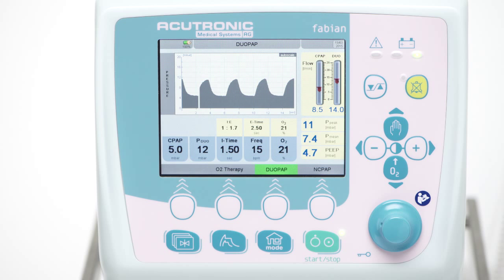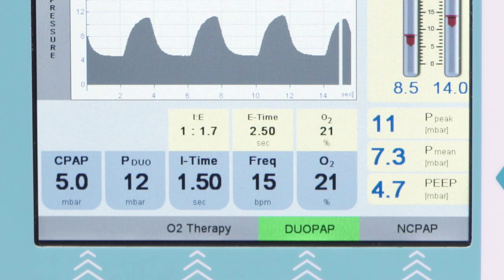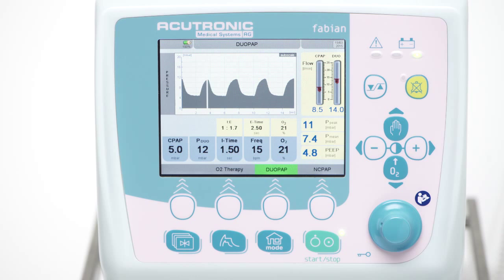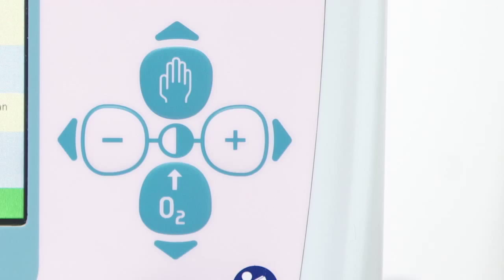By prolonging the inspiratory time with the manual button, the mean airway pressure will increase as well. The P-manual button allows you to start and prolong the desired upper pressure level during a manual inflation to the patient in case of apnea or a lung recruitment maneuver.